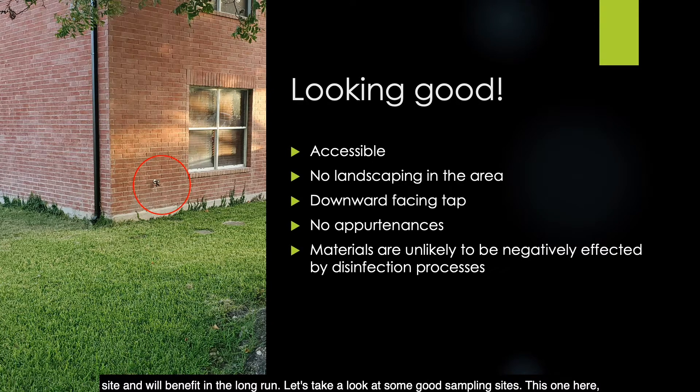Let's take a look at some good sampling sites. This hose bib, shown in the red circle, is looking good. It's easily accessible and visible from the street. There's no landscaping around the hose bib. The hose bib itself is downward facing. There are no appurtenances, hoses, quick connects, or vacuum breakers that you'll need to remove in order to sample. Also, the materials of the home are unlikely to be negatively affected by the disinfection process. This is a site you should include on your sample siting plan.